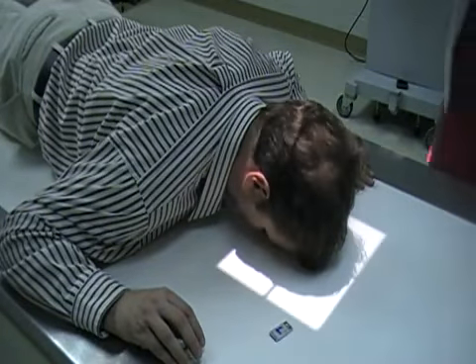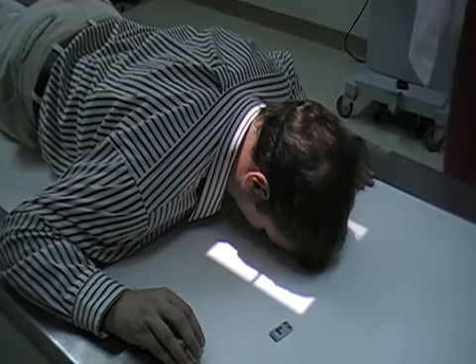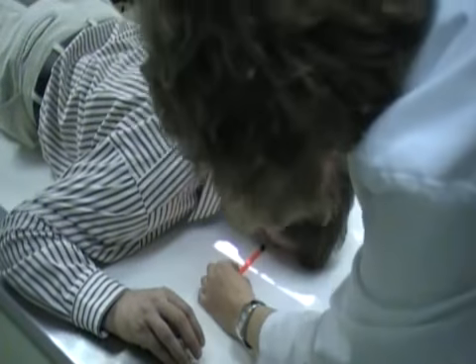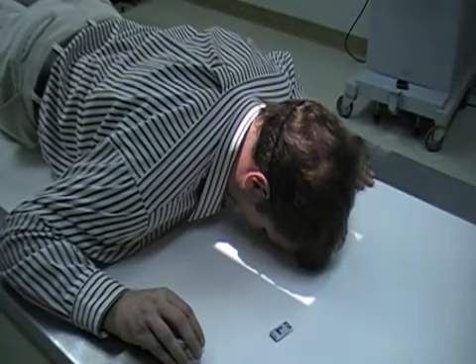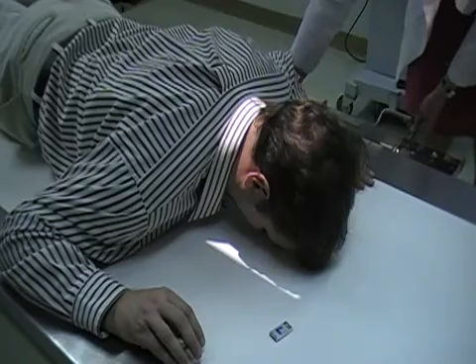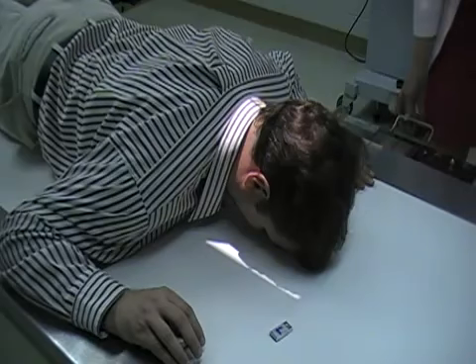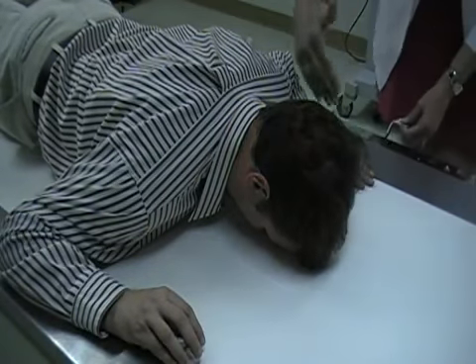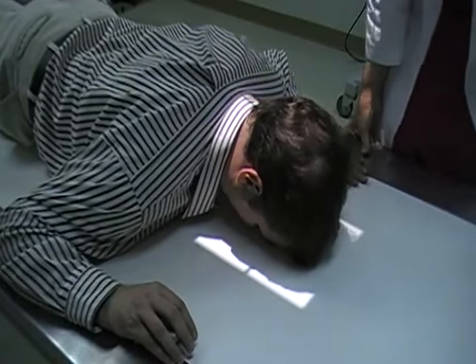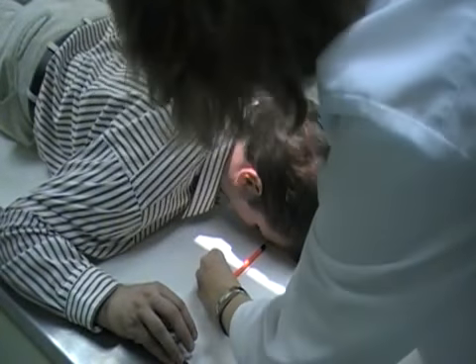Now the central ray is going to exit out of the nasion, so you can do a visual check and make sure that this is the same level as the nasion right there, so I can move my central ray down just a little. And for this, you want to be sure that your image receptor is portrait. Okay, and this is the left side. Okay, that looks better.